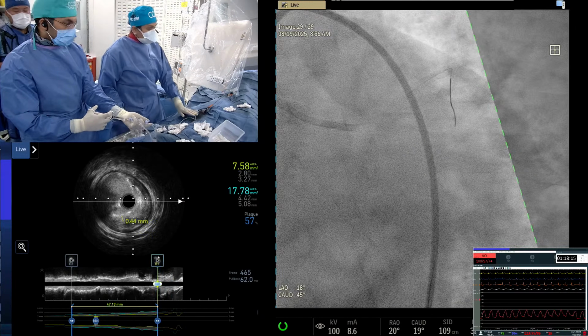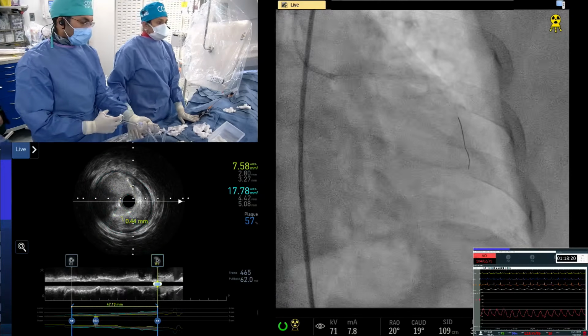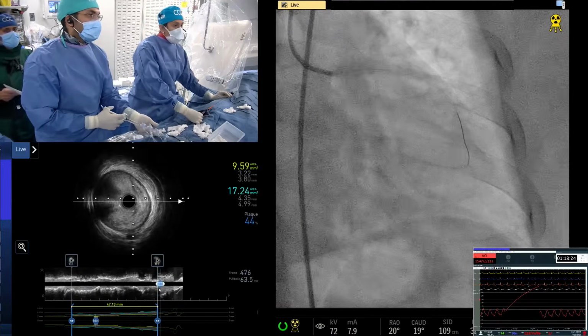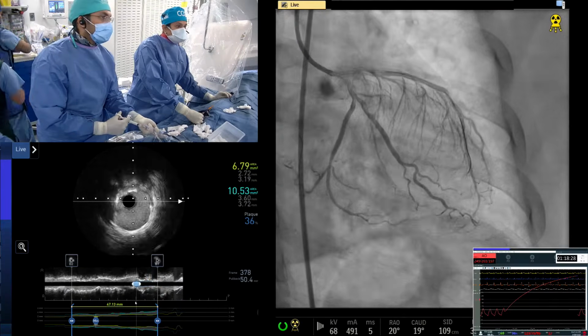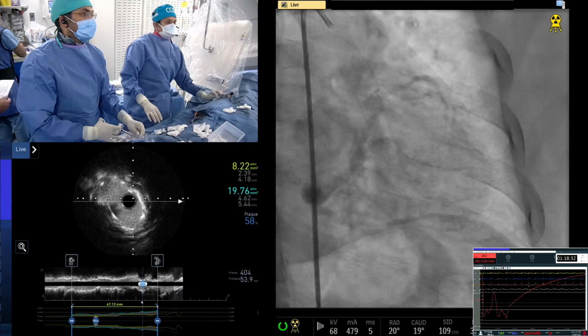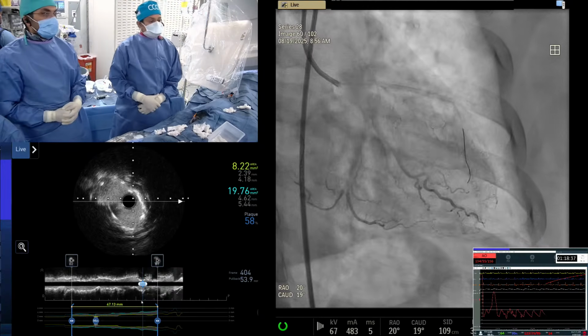Andrew, did we figure out, and do we have it in the device aid? No, it's okay. It's too recent then. And where is that company from? Yeah. They're saying Japan. Okay, looks good.